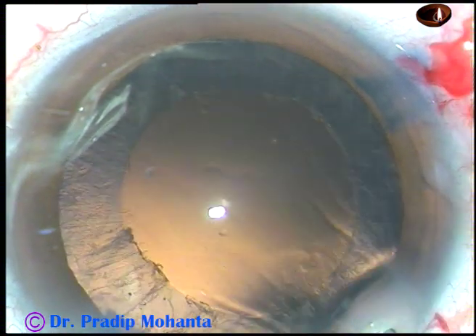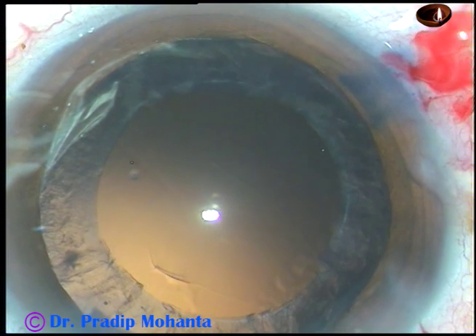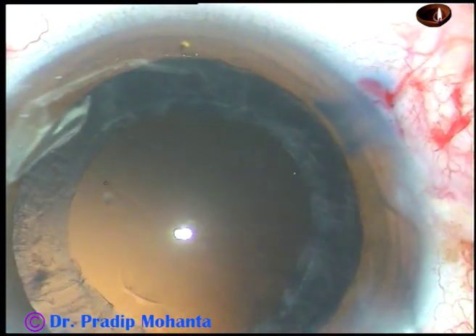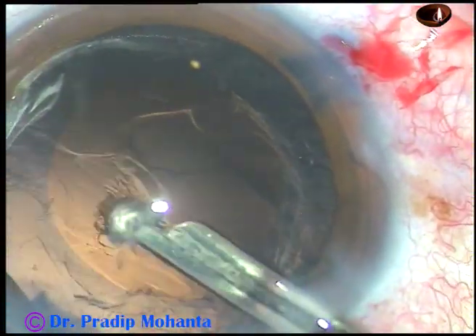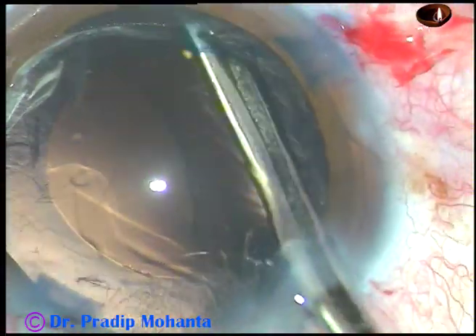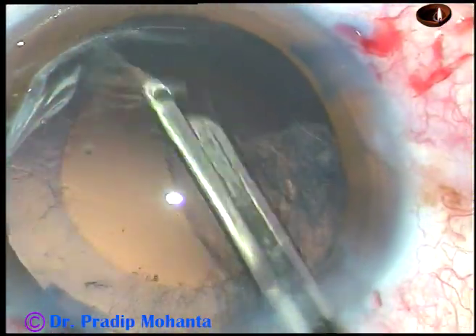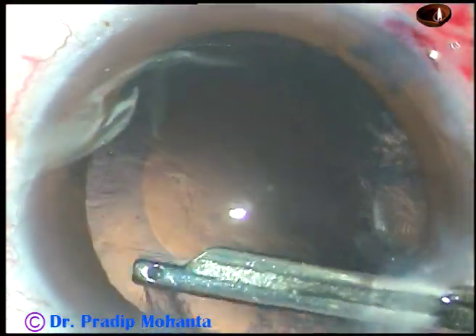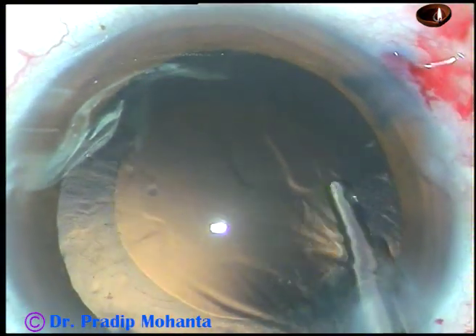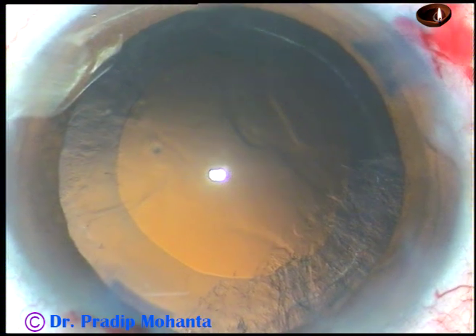Now cortical cleanup is to be done. Visco is injected into the anterior chamber. By the time my assistant gets ready with bimanual IA, I am using this 23-gauge Simcoe to remove some cortex from the inferior part. The cortex from 1 o'clock to 10 o'clock has been removed by this instrument. This is a very efficient and very safe instrument to remove cortex.